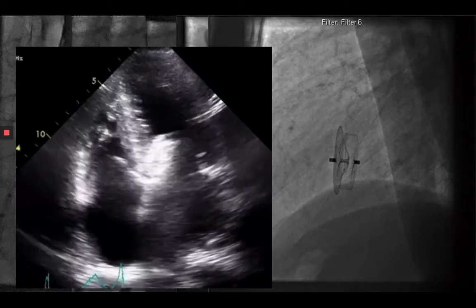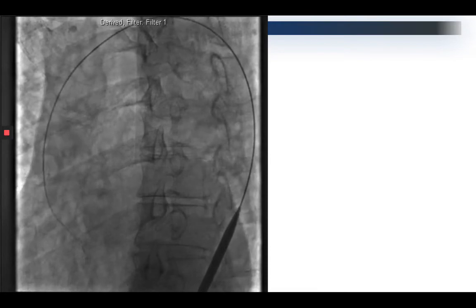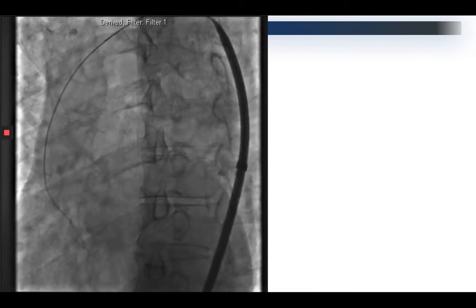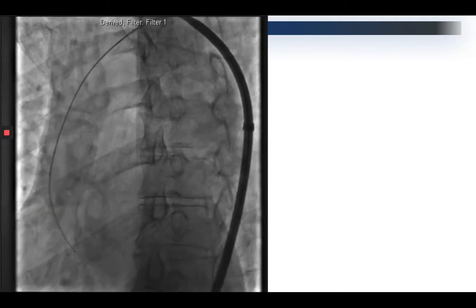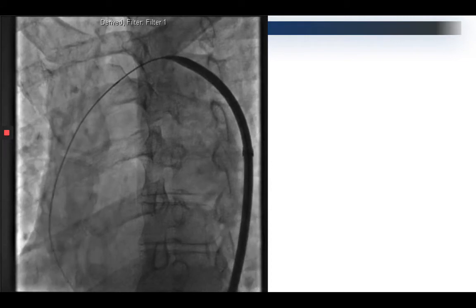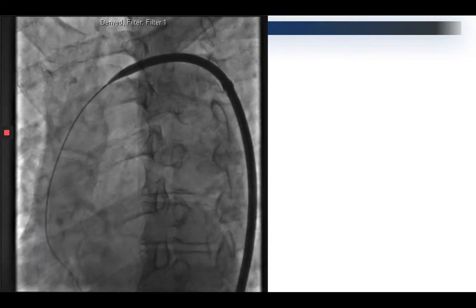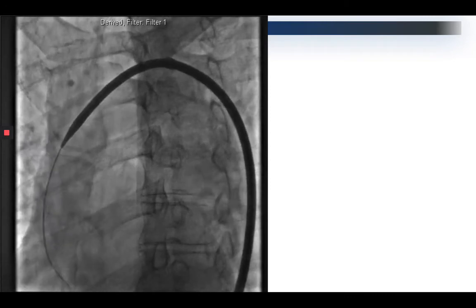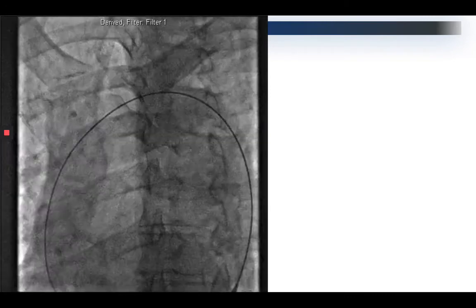So we brought the patient back to the cath lab, gained femoral arterial access with a 14 French sheath with 2 ProGlides to pre-close. This is an 80 centimeter 14 French sheath, which was the largest and longest sheath that we had available at that time in our lab. We advanced that through a stiff implant wire into the ascending aorta.